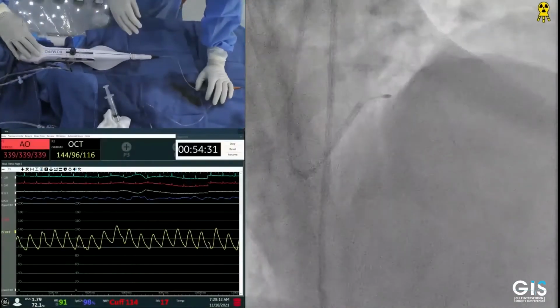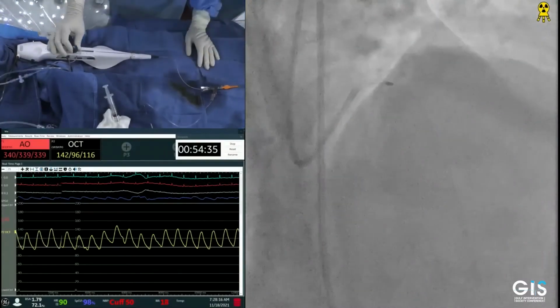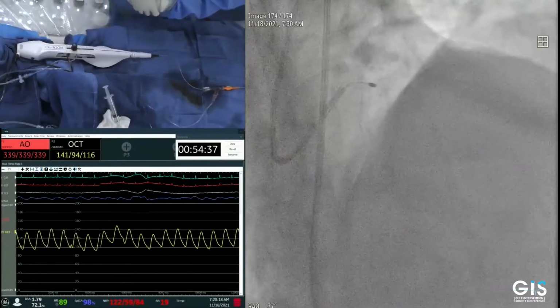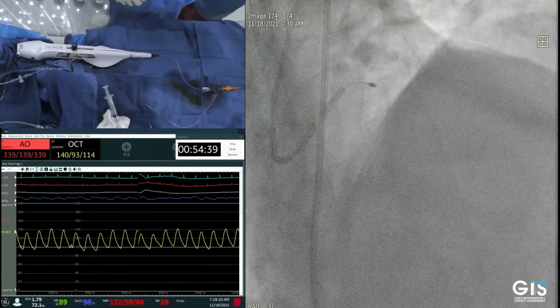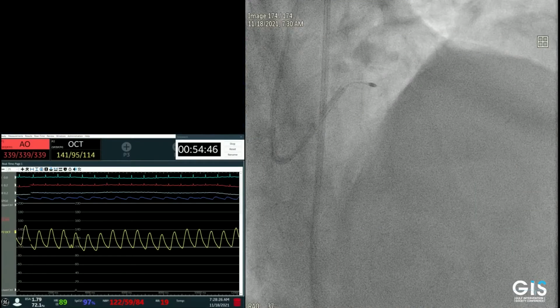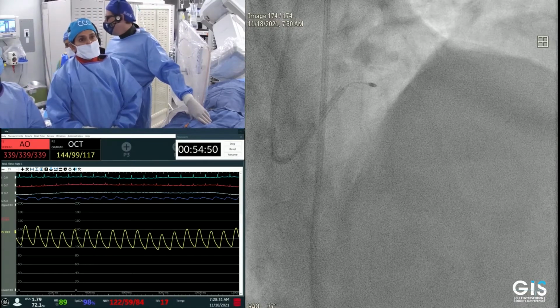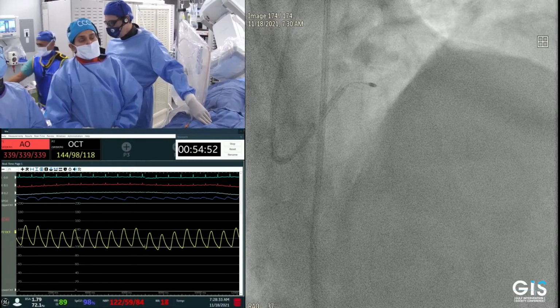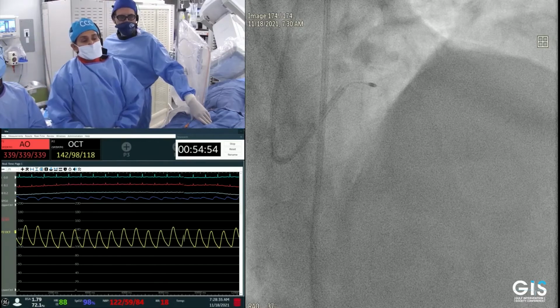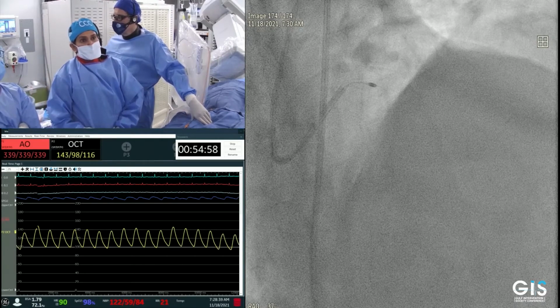So just before starting, you've seen the imaging. Is it complex? Is it a severe calcification here? You think? No, I don't think so. That's my question to you: is this the shockwave artery, or is it a rota artery? Because it's not a severe calcification. It's a moderate type. If we do the calcification score, the OCT, I think this could also be a shockwave artery.